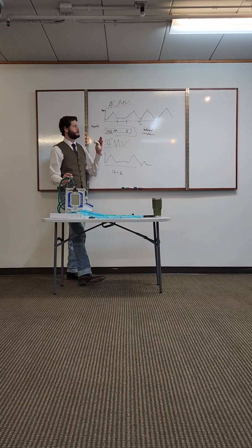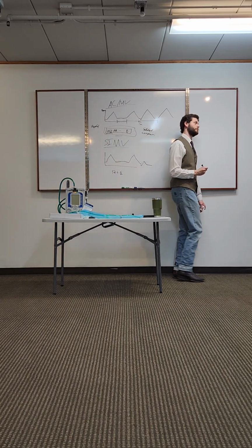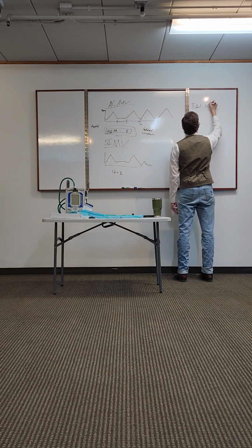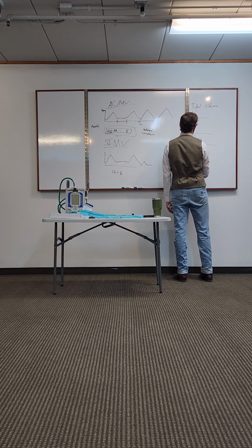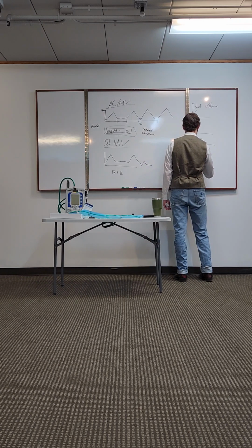So that is the very short and sweet of ACMV versus SIMV. In both of these, you're going to get the same vent settings that you can set for the most part. You're going to have a tidal volume, or, if I look at this, VT. You're going to have a respiratory rate. You're going to have a PEEP. And you're going to have a pressure trigger.